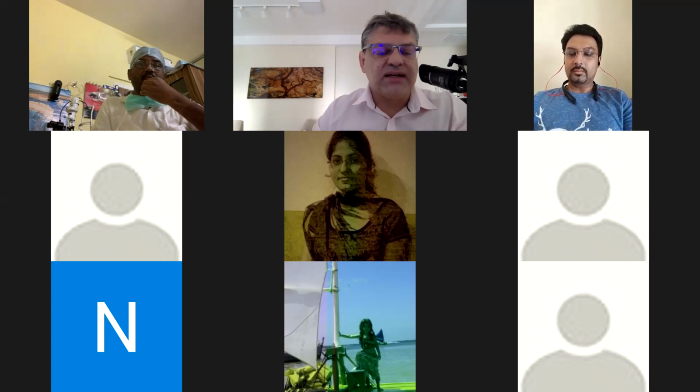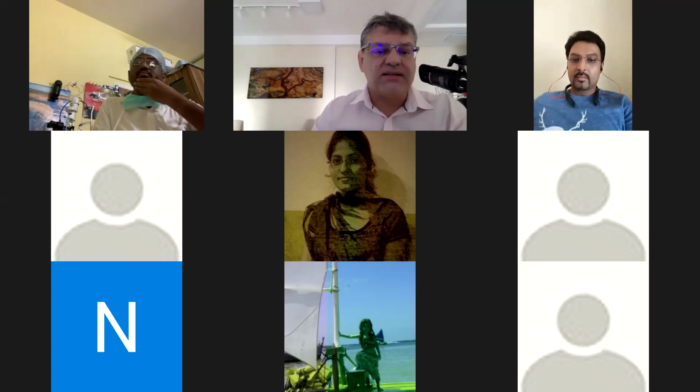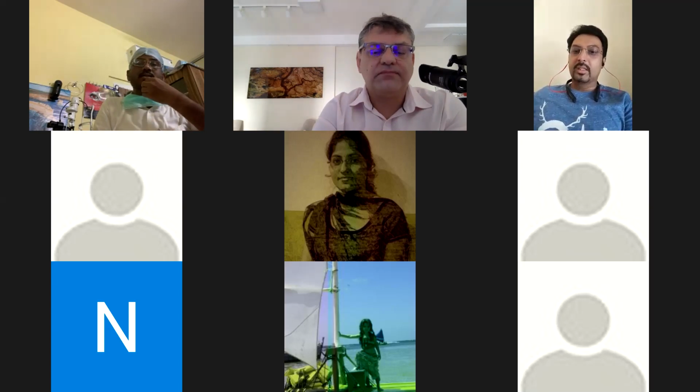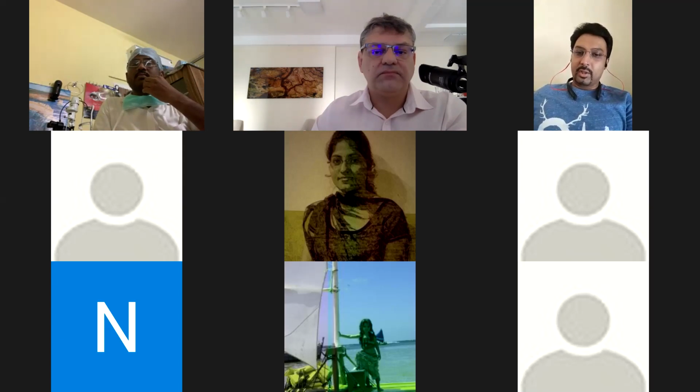That's just an example, but of course, if you have FFA, you're going to get used to that, and autofluorescence helps a lot, as Pooja showed some examples, and I always say autofluorescence is very important. Yeah. Mainly in genetic conditions, genetic disorders, and ARMD, to follow up patients with geographic atrophy, and even in tumors, it is very important.